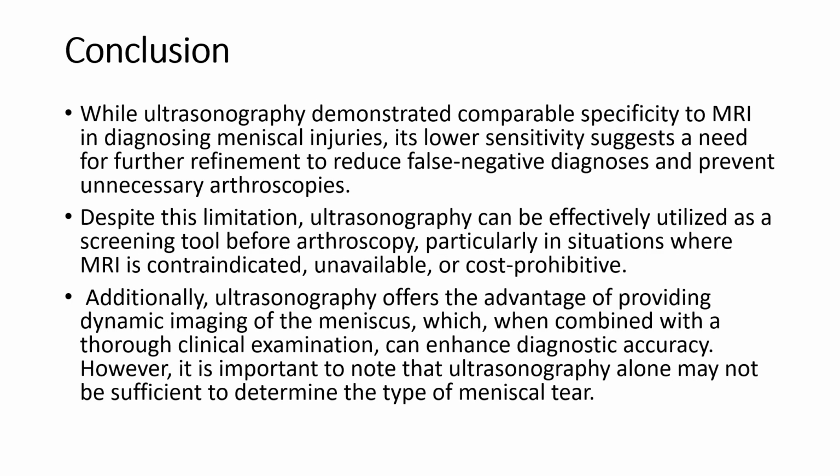The conclusion that we draw from these tables is that while ultrasonography demonstrated comparable specificity to MRI in diagnosing meniscal injuries, its lower sensitivity suggests a need for further refinement to reduce false negative diagnosis and to prevent unnecessary arthroscopies. Despite this limitation, it can effectively be utilized as a screening tool before arthroscopy, particularly in situations where MRI is contraindicated, unavailable, or cost prohibitive.